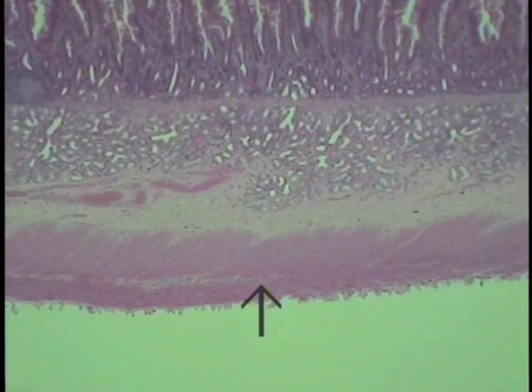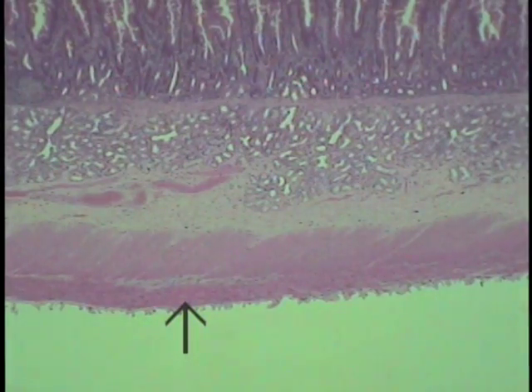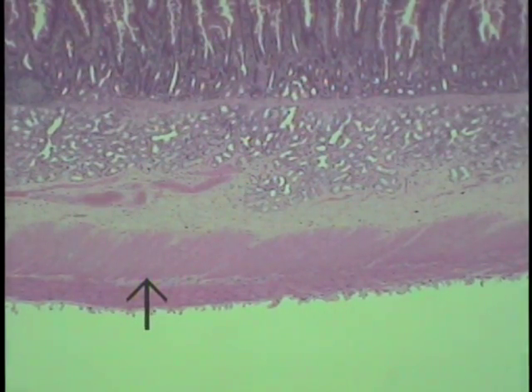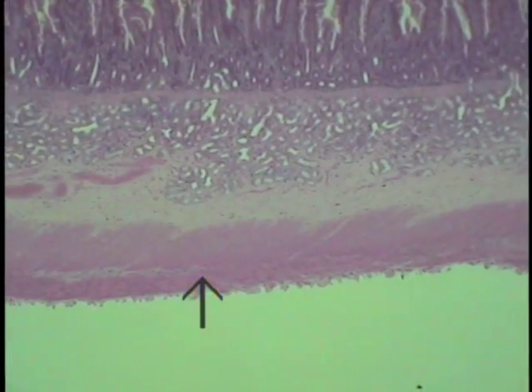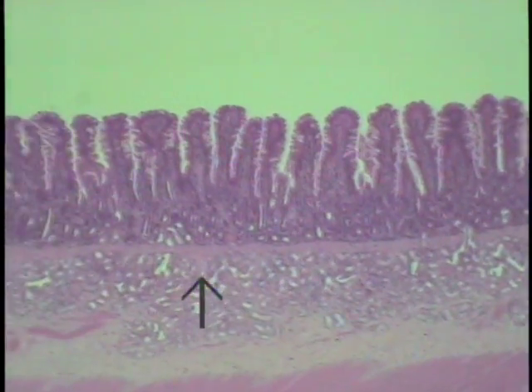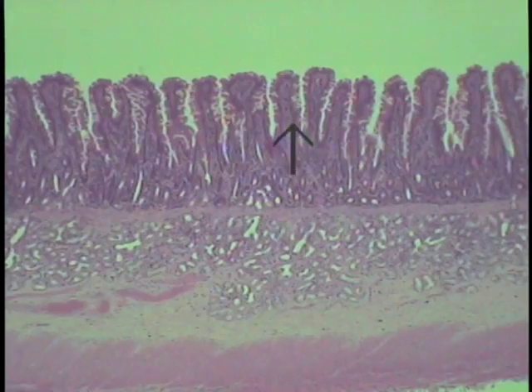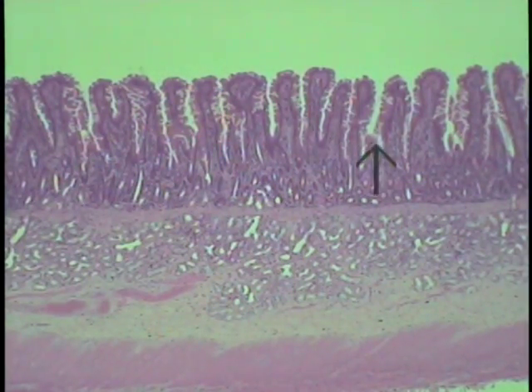In the muscularis externa, one will find in that seam between the inner circular and outer longitudinal layers of the muscularis externa, the myenteric or Auerbach's plexus, which is shown here with this scanning objective. So it's going to be along that connective tissue seam scattered throughout the entire length of this particular system. Having made these sort of macroscopic observations, then proceed to the villi, which are showing these finger-like extensions sticking out into the lumen, and examine these structures at increased magnification.